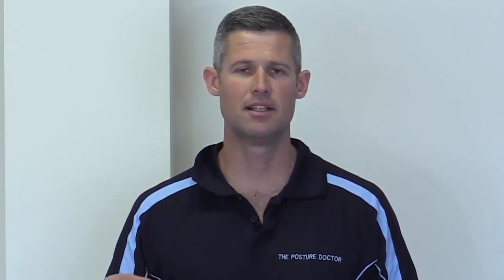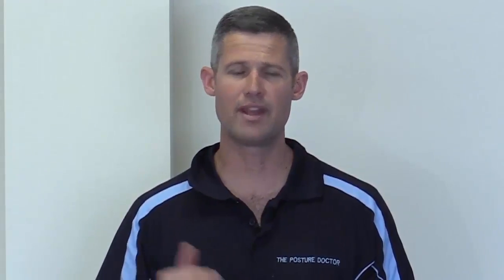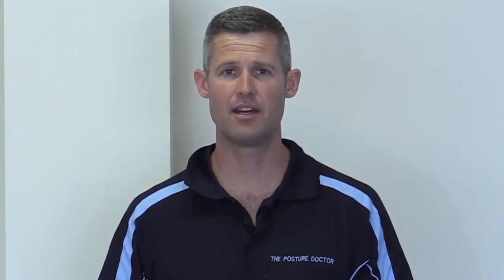If you are okay with that 1 minute the following day, you don't have any aches and pains in that area of your spine, you'll increase to 2 minutes, and you increase this by 1 minute every single day until you're up to 10 minutes. Now at 10 minutes, the ligaments in your spine that support your spine start to permanently stretch. And this is where we're able to correct the postural problem that we found on your x-ray and in your postural analysis. So I'll demonstrate for you now how to use a thoracic lift.